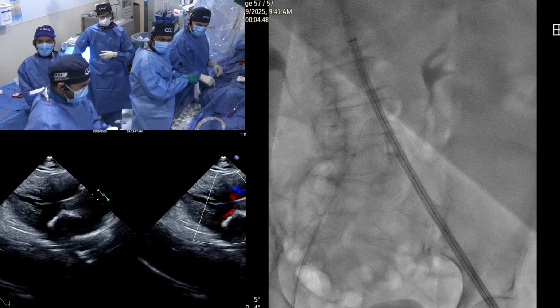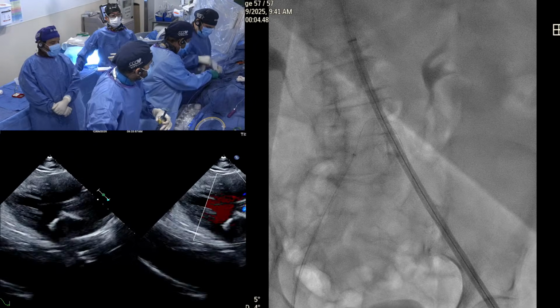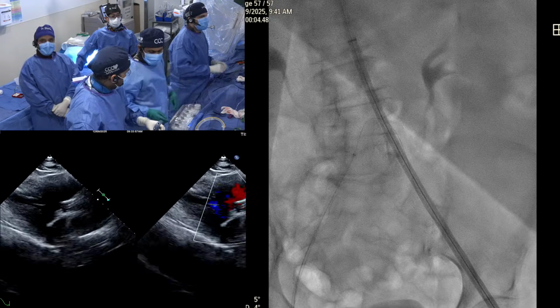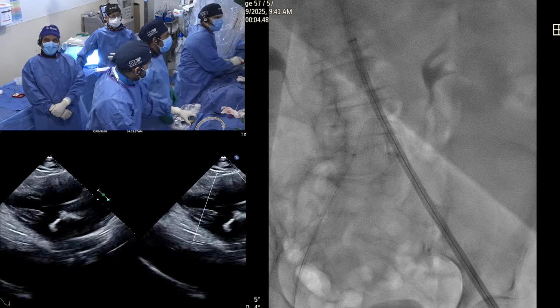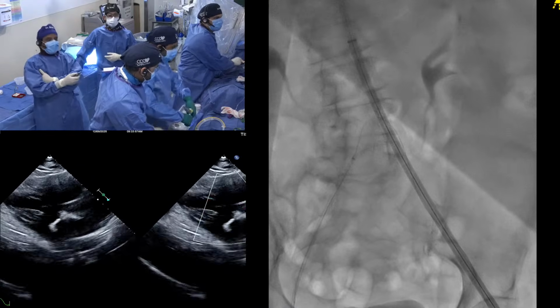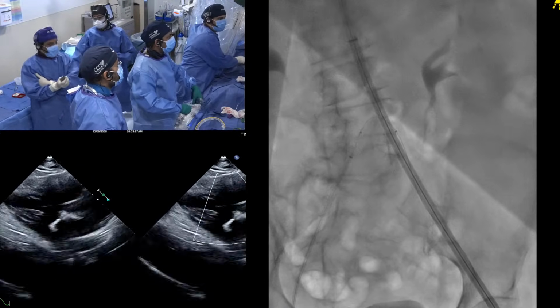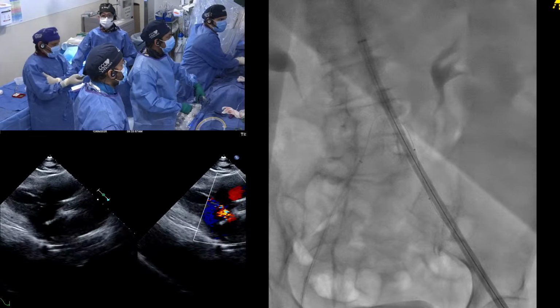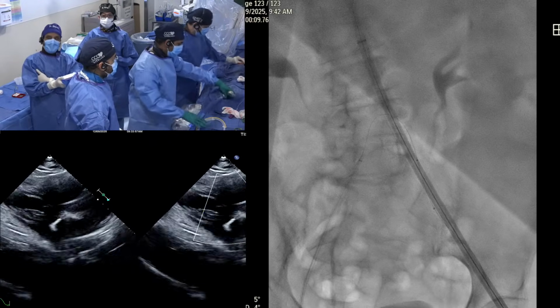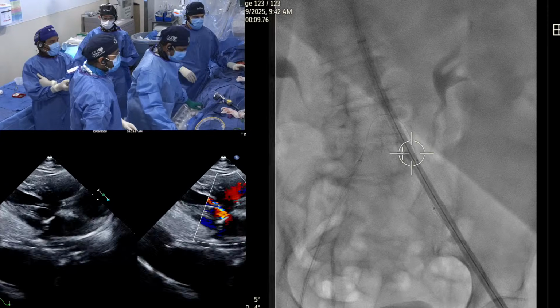I think the Navitor and Edwards are at a similar number, about 5-8% each. About 20-25% is the Evolut, and 50-55% is the Myval. So again, for aortic regurgitation, Myval is not specifically for aortic regurgitation, although it has different sizes, maybe a little better, but it still remains. In selected cases of AR, we have used current self-expanding or balloon expandable valves.